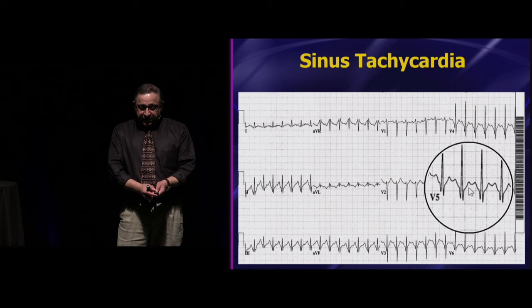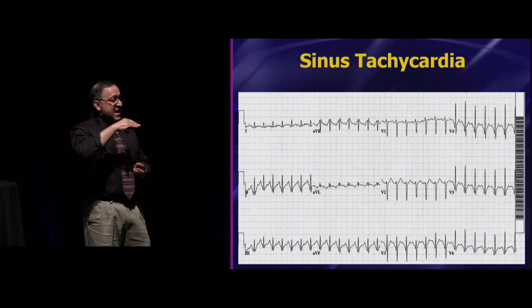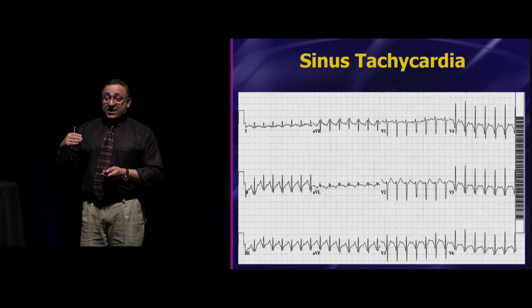So sinus tachycardia. By the way, how fast can you mount a sinus tachycardia? This can be a helpful pearl. This is not 100%, but it's pretty good. How fast can a person's heart produce a sinus tachycardia? Anyone know? I didn't really hear it. So generally, it's 220 minus your age. Is that what she said? All right, perfect. 220 minus your age.